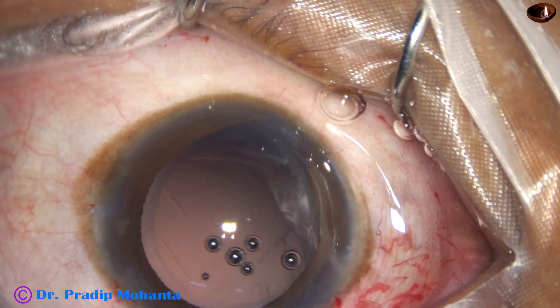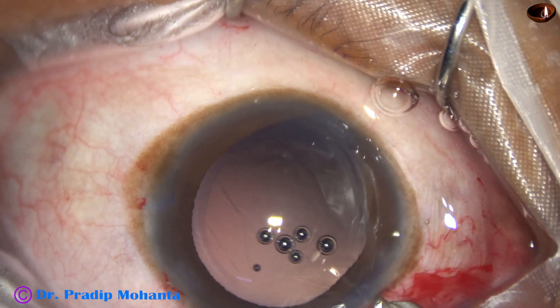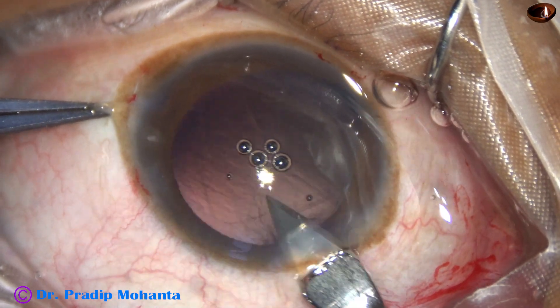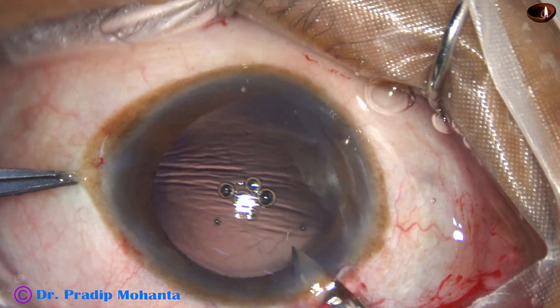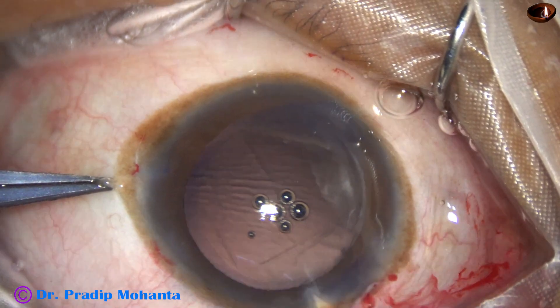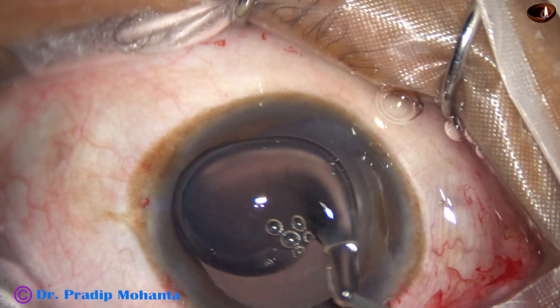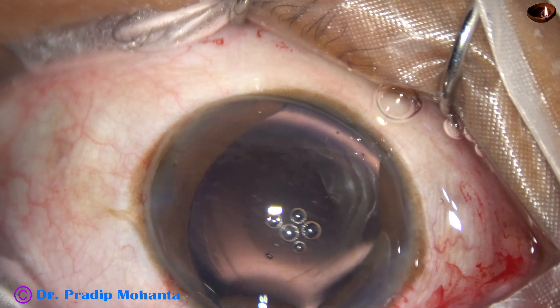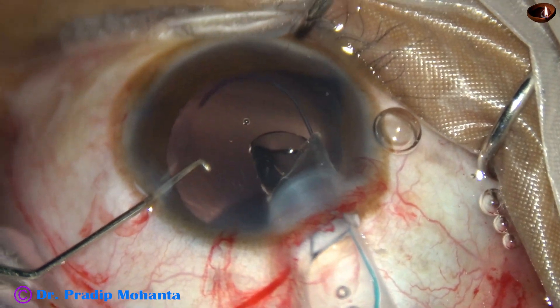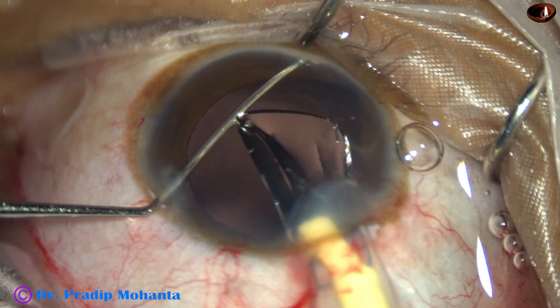The cortex is clean. There is a small nuclear piece — it is removed. Now is the time to enlarge the main wound because I am going to use the three-piece lens from Auro Lab. The cartridge is very wide and we have to enlarge the main wound to about 3.75 millimeters, almost 4 millimeters.